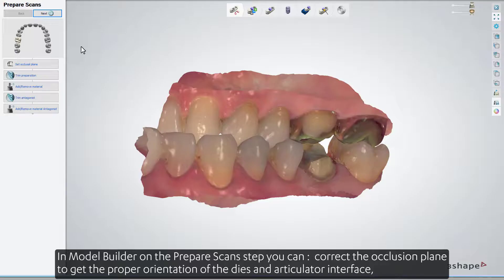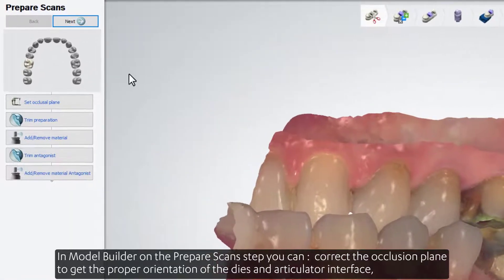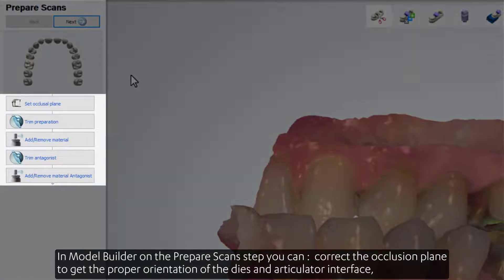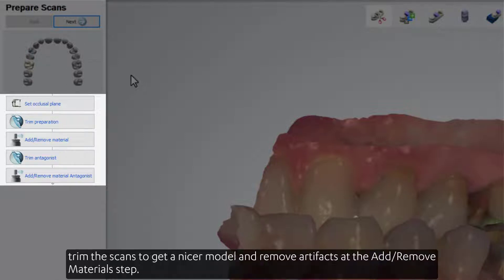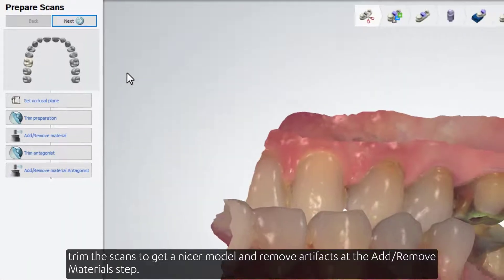In Model Builder, on the Prepared Scans step, you can correct the occlusion plane to get the proper orientation of the dies and articular interface, trim the scans to get a nicer model, and remove artifacts at the Add-Remove Material step.